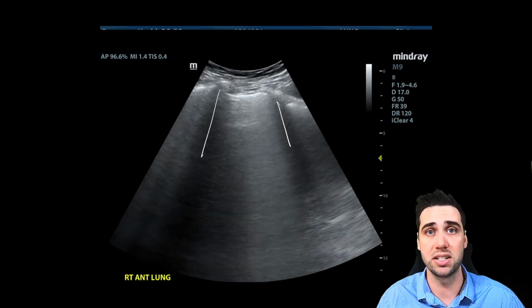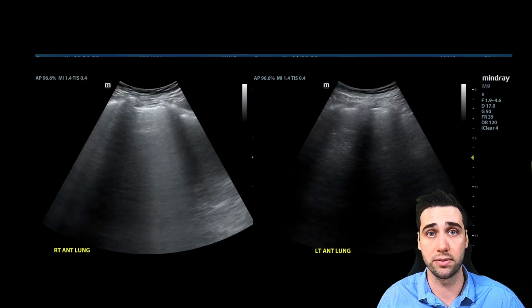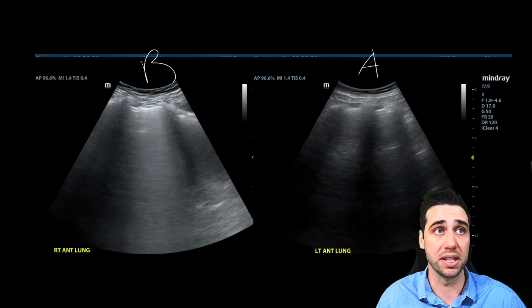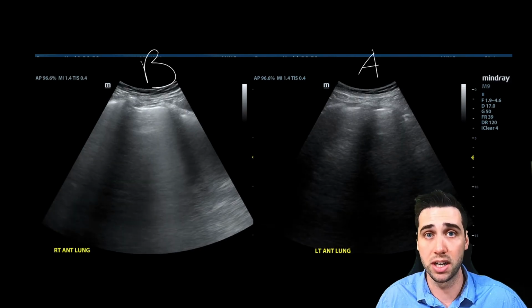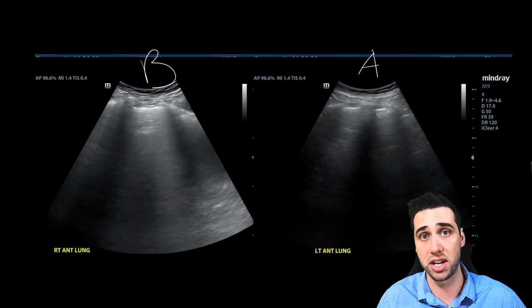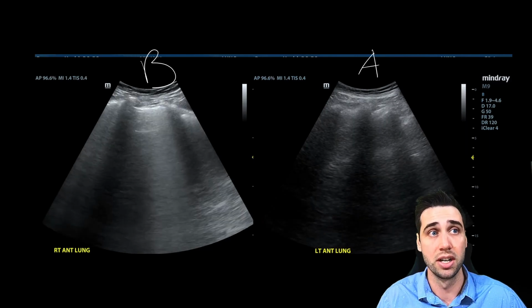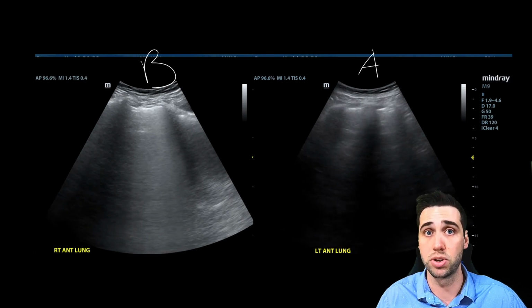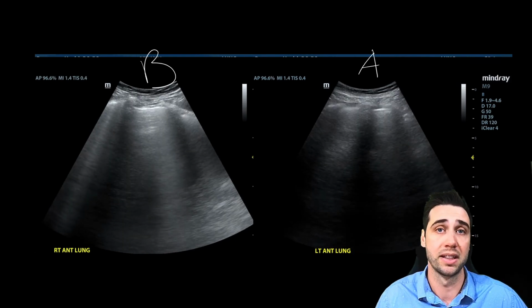So let's put that next to a picture of A-lines and see if you can tell the difference. Over here, we have normal A-lines, and over here, we have B-lines. B-lines can be pneumonia, pulmonary edema, a lot of things. And we'll talk about that, like I said, in the pathology lecture. But I just want you to be able to recognize them and say whether or not they're present when you're doing basic lung ultrasound. That's basically it.